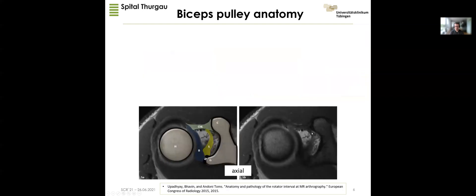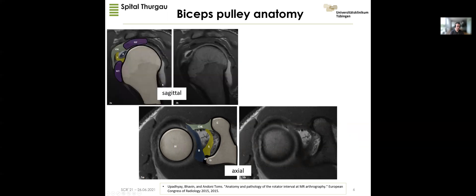How does it look on MRI? In these classic images from the literature, the SGHL is nicely shown here, and then we have the coracohumeral ligament coming from the lateral part of the coracoid process. This is the biceps tendon. Axial and sagittal views are the most important views to assess the biceps pulley system. Here again we can see the long head of the biceps tendon and, in between the subscapularis, the SGHL which should be visible, and a very thick coracohumeral ligament in this patient, with the supraspinatus tendon above.